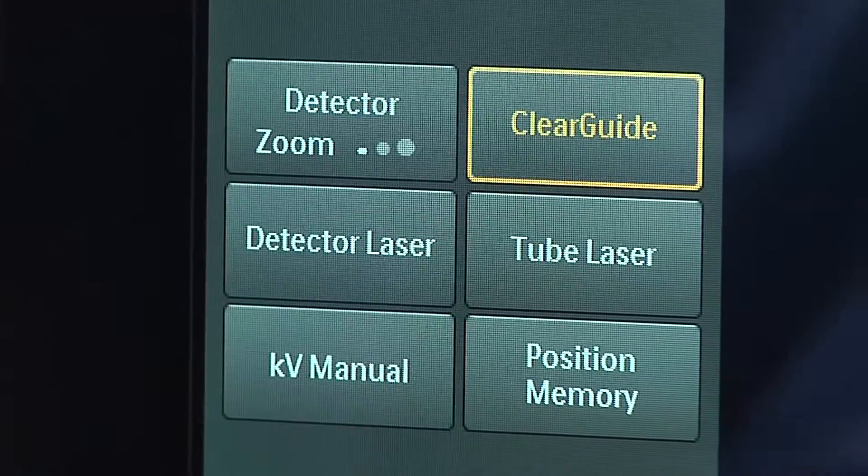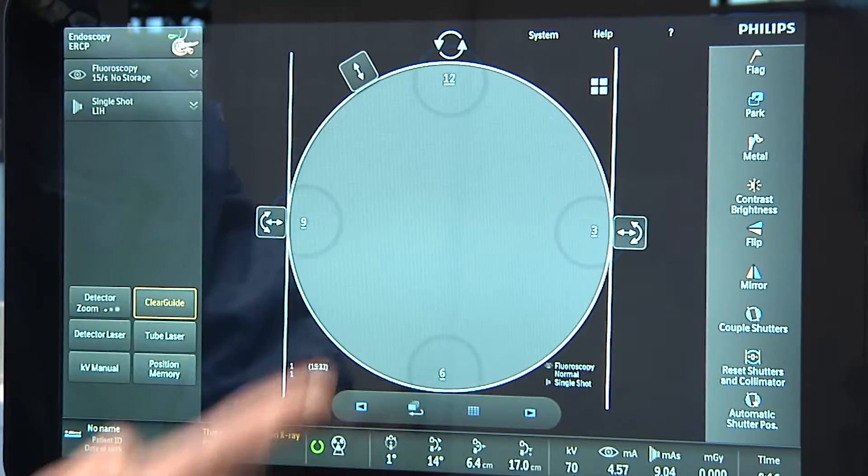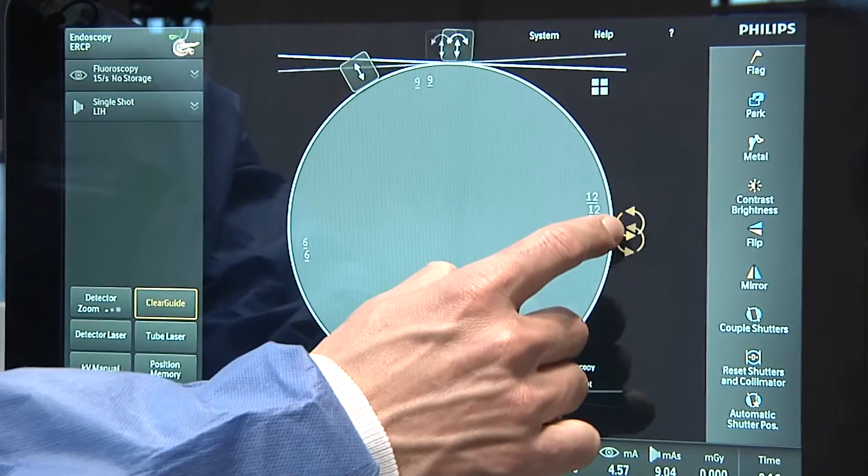In the past we always had problems in communication from the assistant to the doctor. It's always a problem because you tell the assistant to push the C-arm on the right side and it pushes on the left side. It's also due to the fact that the system is working on the opposite side of you, and I think the Clear Guide gives the option to clearly say what you want and to tell the direction of the C-arm.